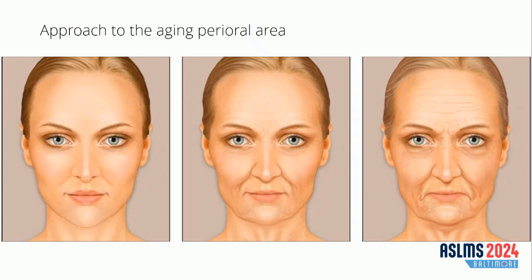And then just a couple of examples. So this is a patient where we performed neuromodulator 2 weeks prior to fractional CO2 resurfacing, so nice result. We did not follow up with any injectables. This is a patient who similarly did neuromodulator to open up the eye area, lift the brows, soften crow's feet, and then performed fractional CO2 resurfacing followed by injectable skin booster in the infraorbital area.